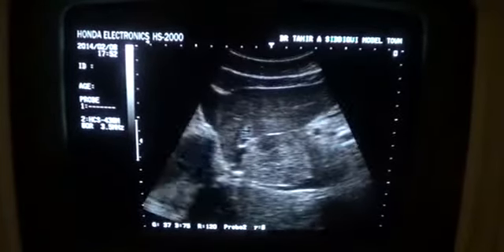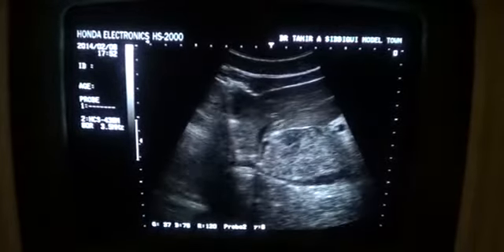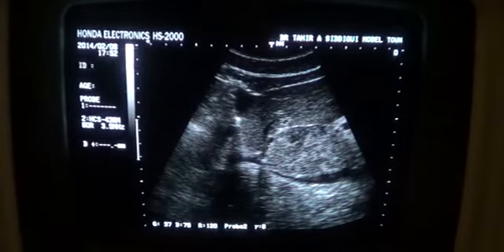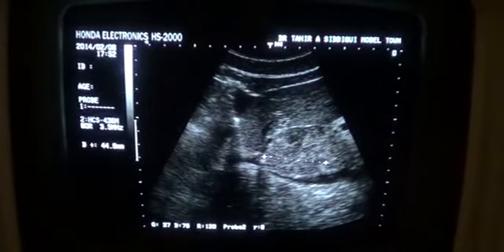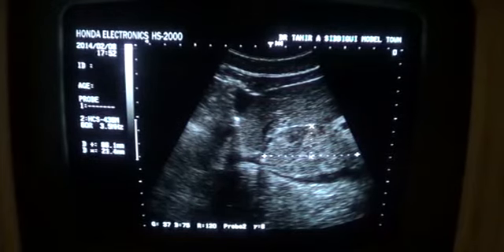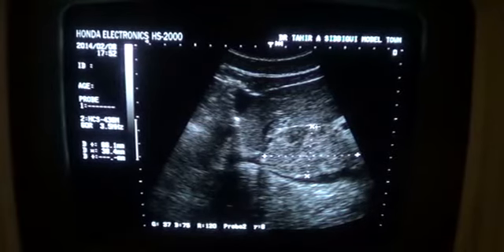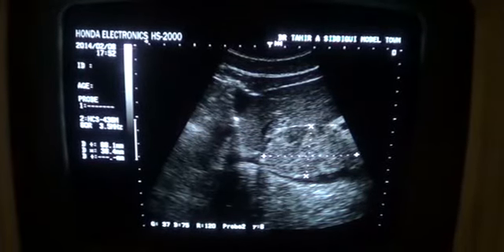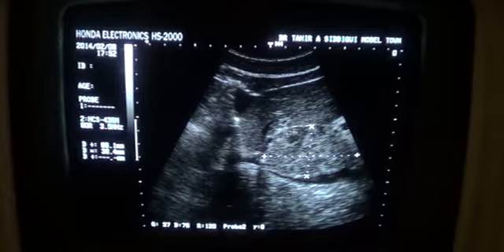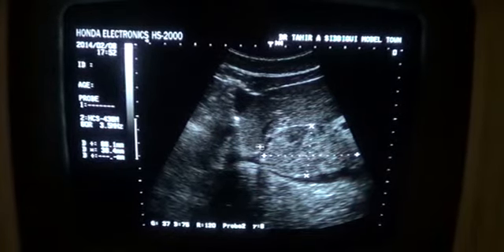What is this? In this view, you are seeing that this is segment 1, or the caudate lobe of the liver, having a heterogeneous appearance, and this linear thread-like slightly curved structure is the ligamentum venosum, and this is the left hepatic artery.